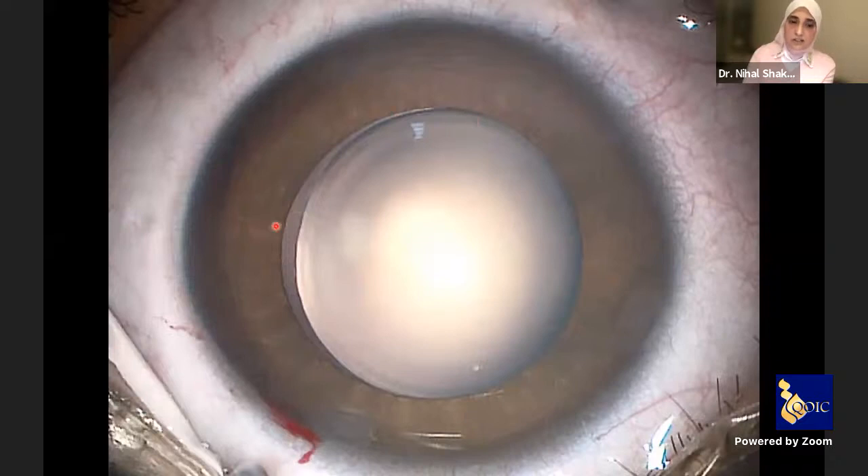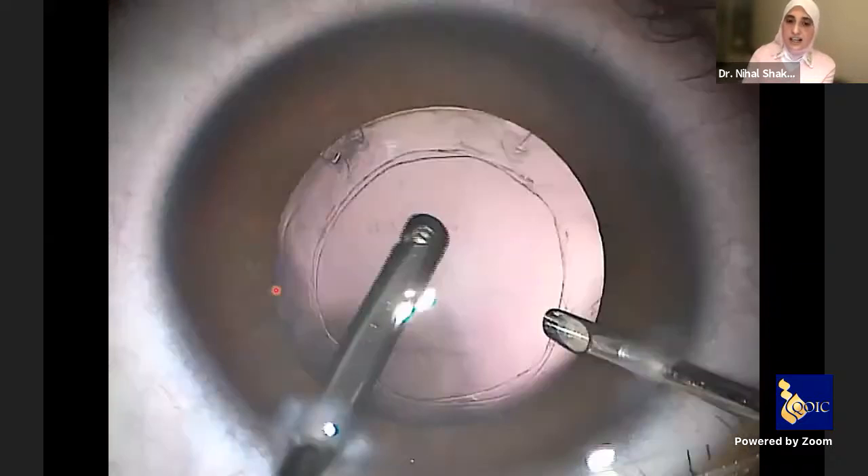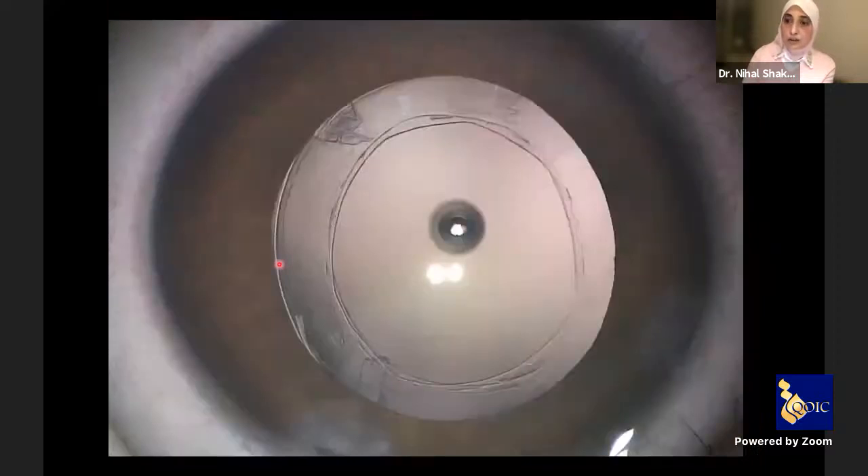Why? Because if there is a large microspherophakia and you leave a beautiful anterior and posterior rhexis at conclusion of surgery, a few months after surgery there will be complete fibrosis of the capsular bag, shrinkage, and elongation of the zonules — because the zonules could not withstand the normal fibrosis of the capsular bag. They are originally diseased.